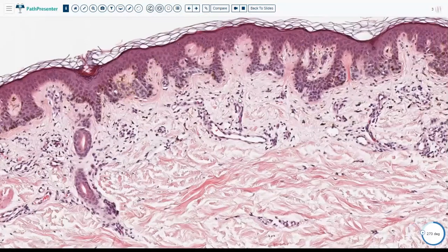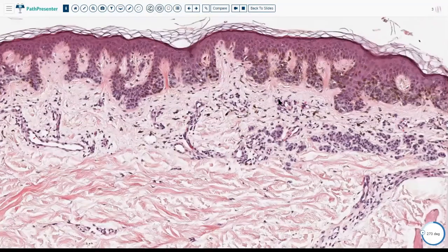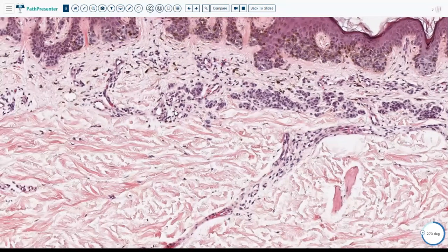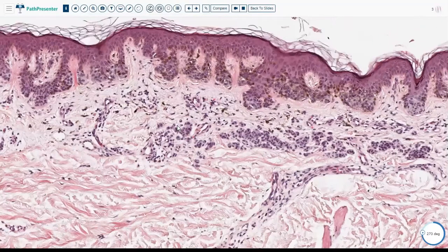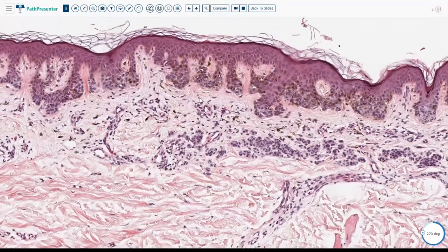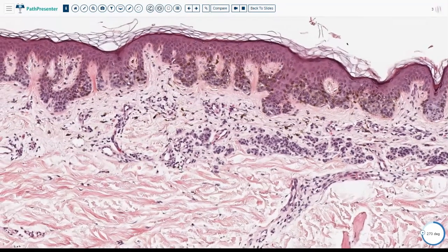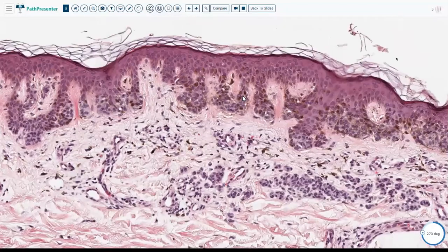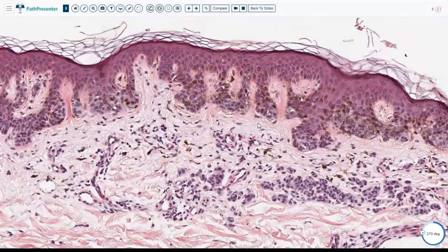What makes me think this is a dysplastic nevus, not a melanoma? Again, you can see normal maturation: cells go down and become smaller nests, scattered down to the base. There are not many single melanocytes in the epidermis as much as there are nests. That's a very important feature. In the epidermis, you should always see nests. In the dermis, you should always see scattered cells. When it's the opposite, and you see a lot of scattered cells in the epidermis and a lot of nests in the dermis, that's when you start to be concerned. There's no pagetoid spread of melanocytes, which makes me even more comfortable.